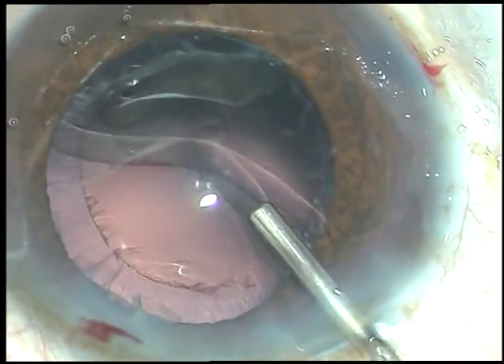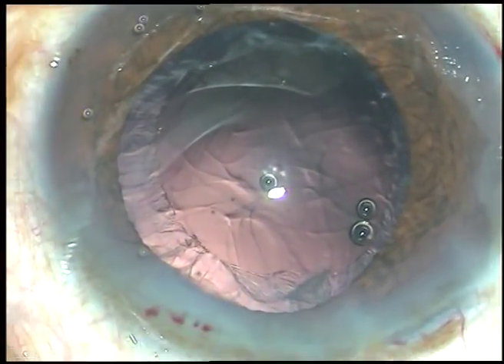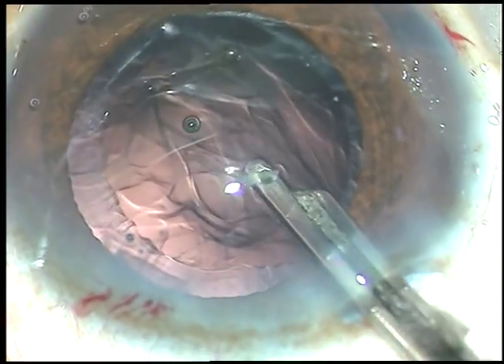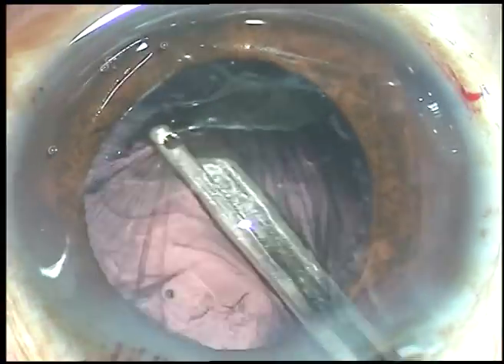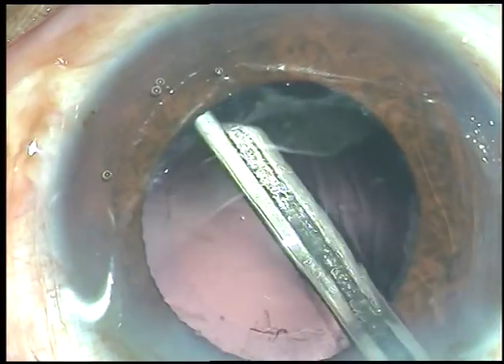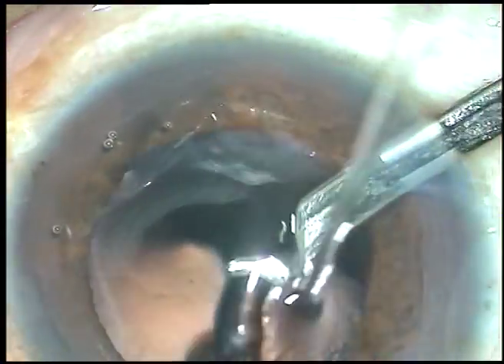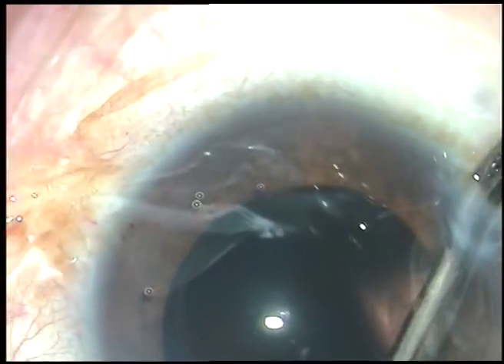A small bit of nucleus or epinucleus must be removed first — like this — before you remove the cortical matter. Because this small nuclear bit may get lost underneath the iris, and after one month or so, you can see it settled in the anterior chamber angle at 6 o'clock, and the overlying endothelium may be decompensated. So take care to remove any small nuclear bit before you remove the cortical matter.